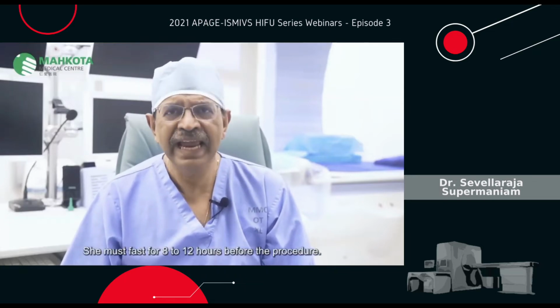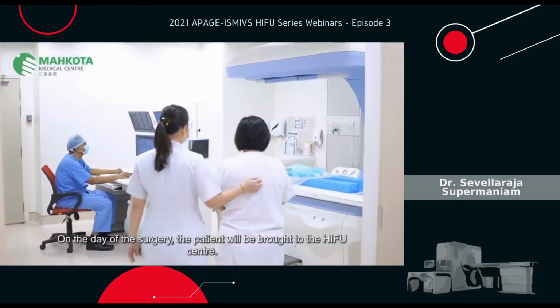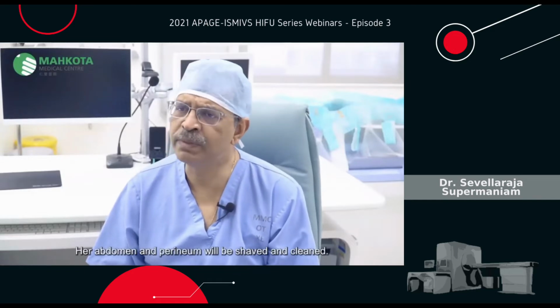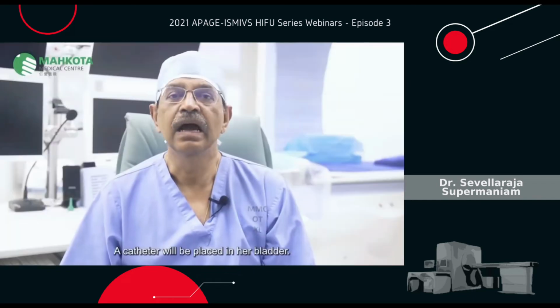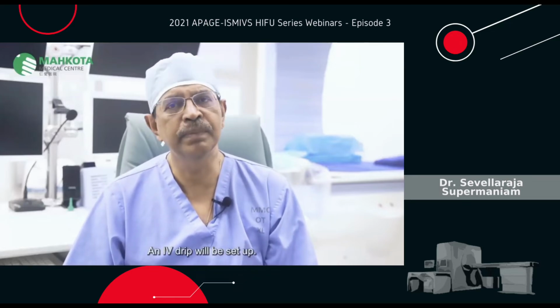She must fast for 8 to 12 hours before the procedure. On the day of the surgery, the patient will be brought to the HIFU center. Her abdomen and perineum will be shaved and cleaned. A catheter will be placed in her bladder. An IV drip will be set up.